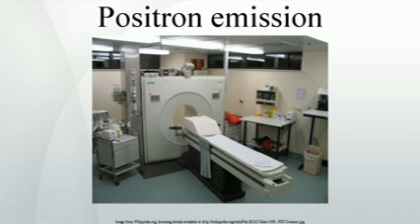PET imaging is best performed using a dedicated PET scanner. However, it is possible to acquire PET images using a conventional dual-head gamma camera fitted with a coincidence detector. The quality of gamma camera PET is considerably lower, and acquisition is slower. However, for institutions with low demand for PET, this may allow on-site imaging, instead of referring patients to another center, or relying on a visit by a mobile scanner.